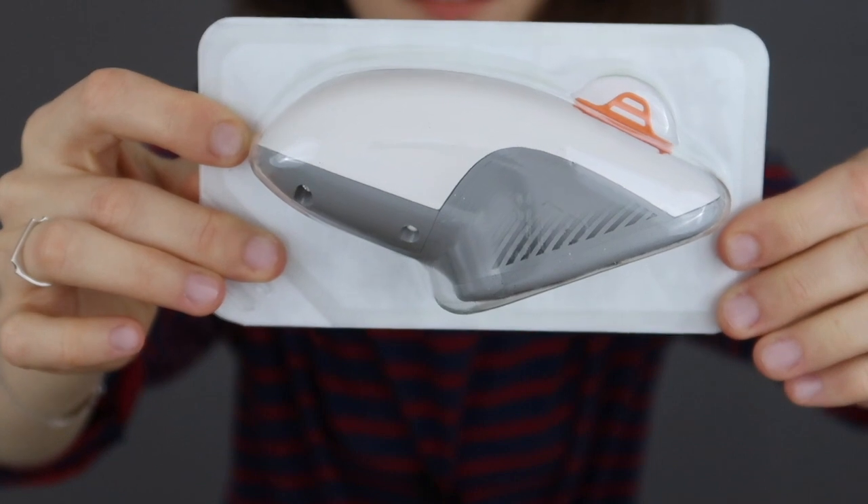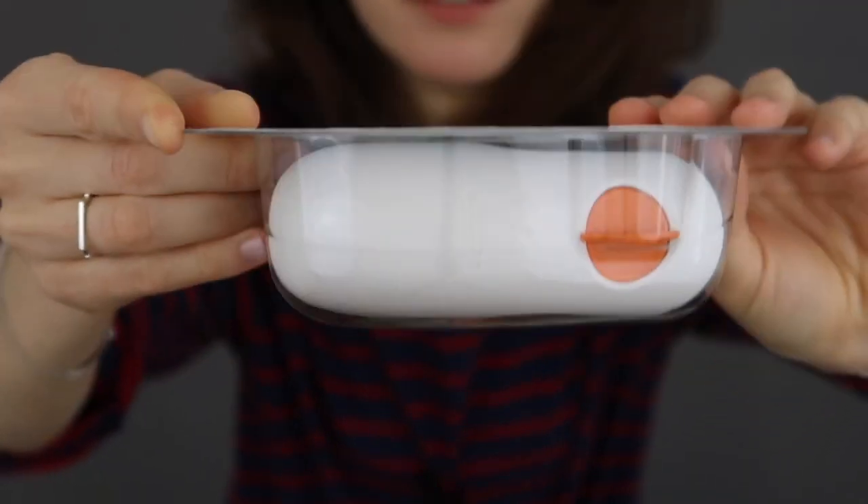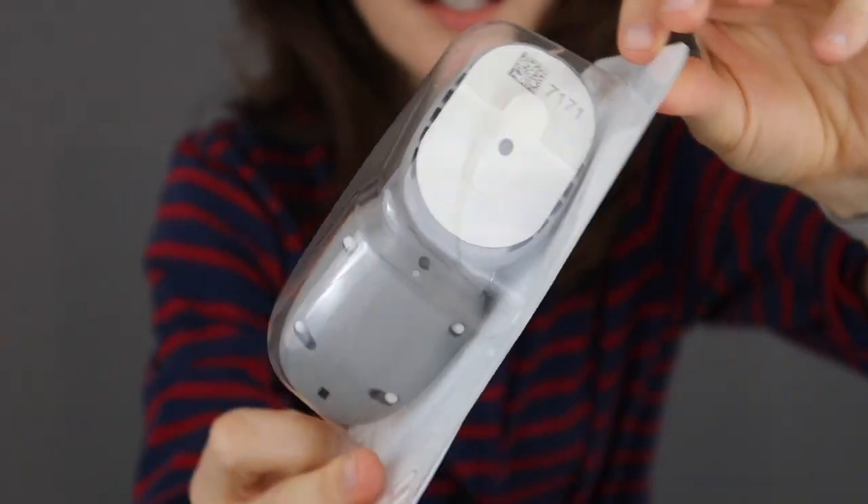So here we go — wow! That is how the inserter, which already has the sensor in it, that's how it all comes packed.